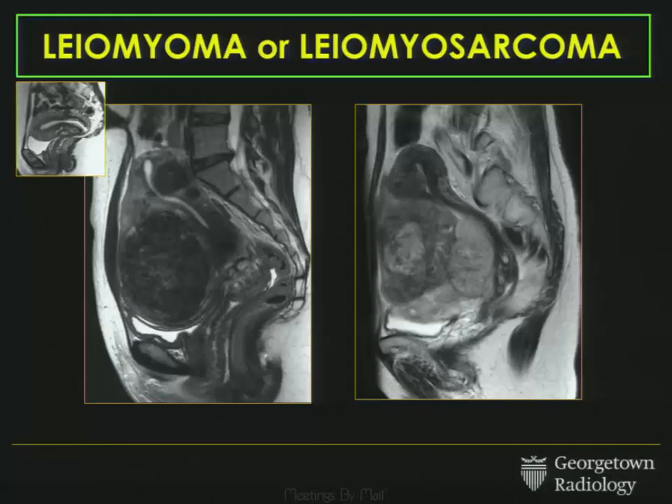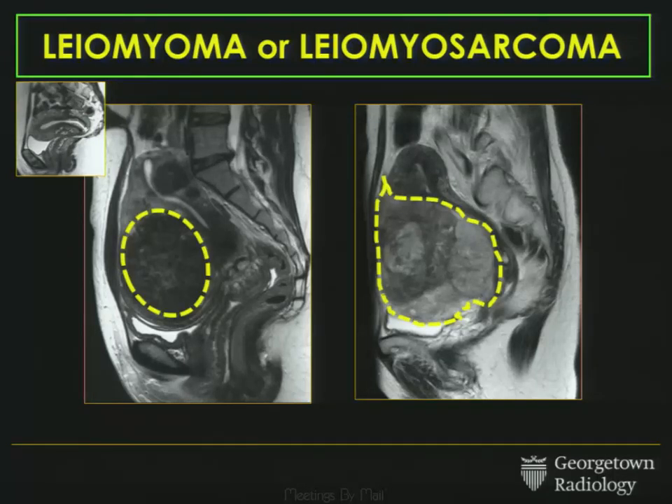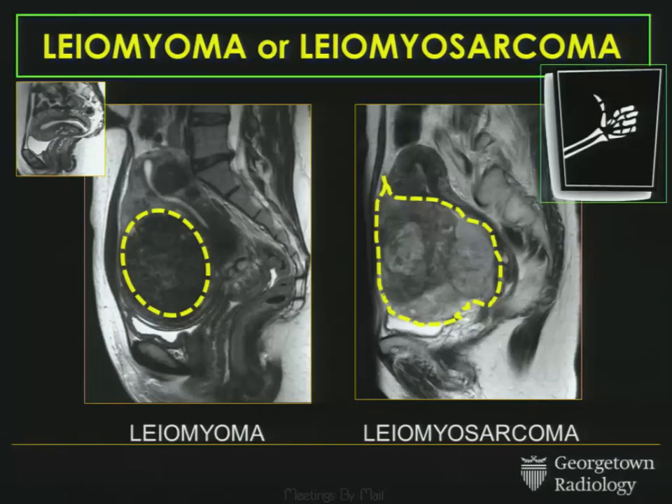I was going to try to use the audience response system, but that wasn't working consistently, so we're just going to do it for ourselves. Two patients, two different patients. I want you to look at the dominant lesion in each uterus and decide whether one's a fibroid or one's a leiomyosarcoma. I think we would all agree that the one on your left is a normal fibroid, and the one on the right is more worrisome — and that's a sarcoma. So that's the first case.